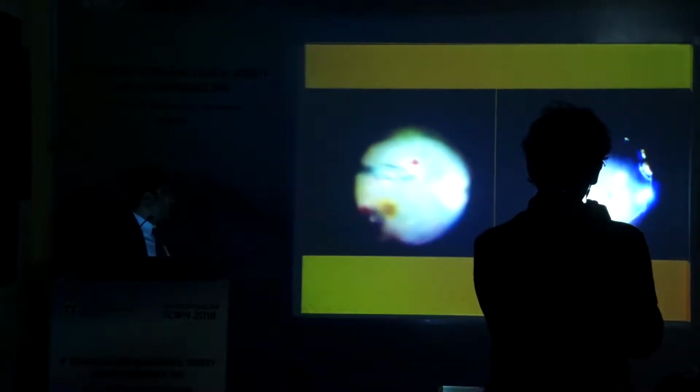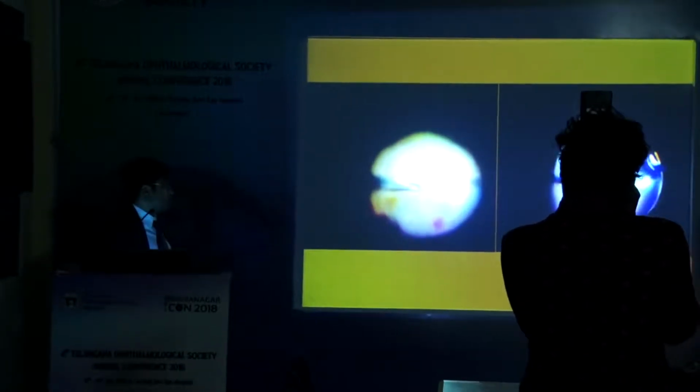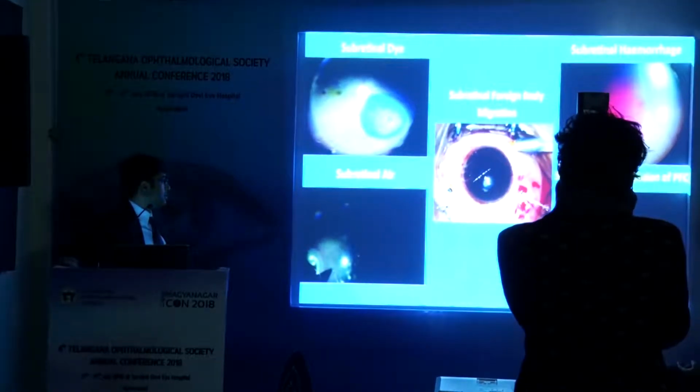Vitreoretinal surgery involves complex and intricate maneuvers which can be unforgiving at times. We now present a compilation of these rare complications during vitreoretinal surgery and their management.